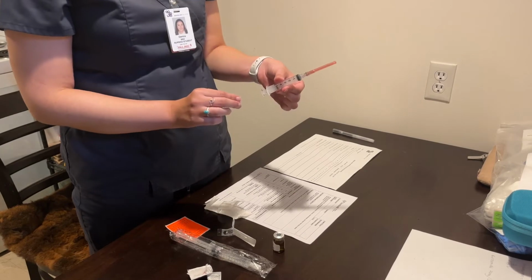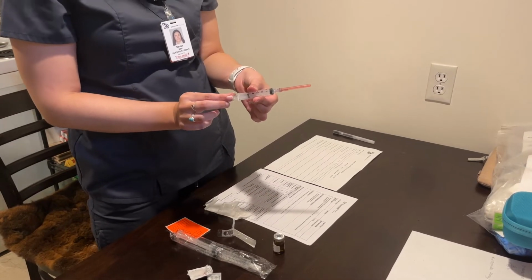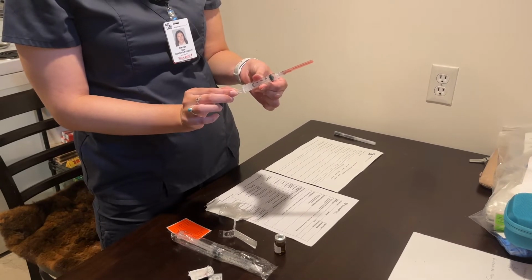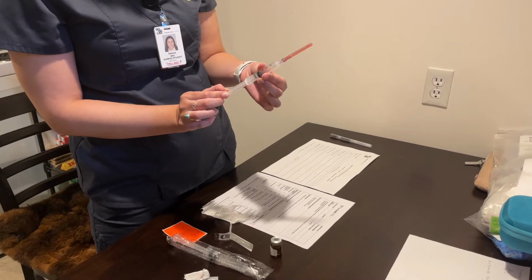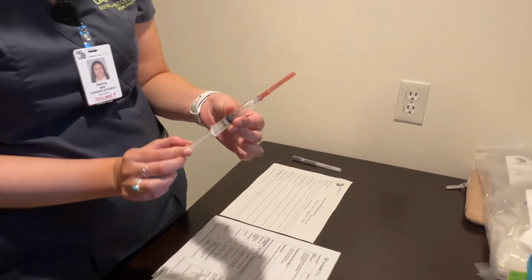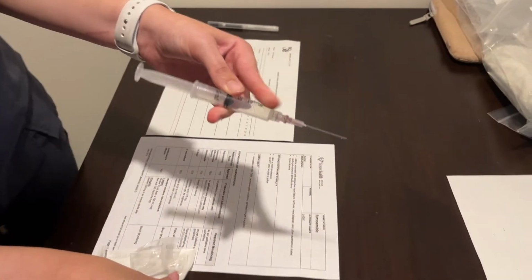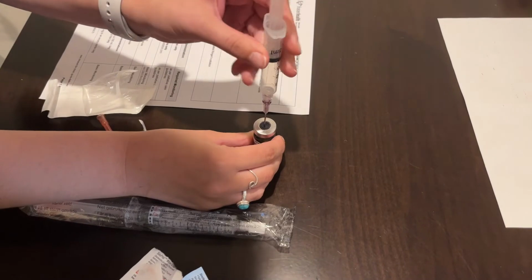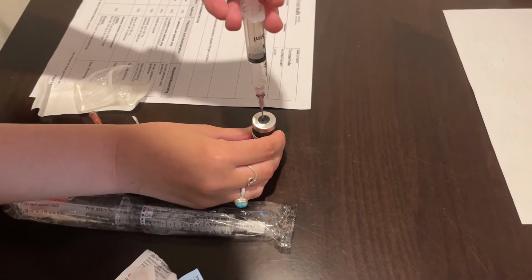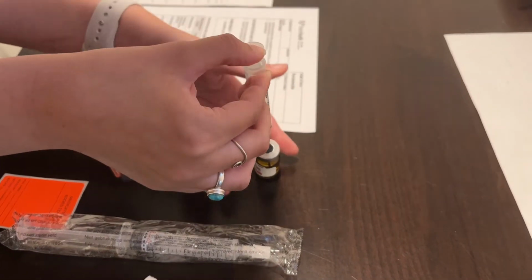Okay, now that we have it on and the alcohol has dried, since we're doing it into a vial, I'm going to inject air into this. So I'm going to pull the plunger down to 4 mils. So that's the amount of air I will be doing. And I'm going to put it into the vial just a little bit and then inject the air.